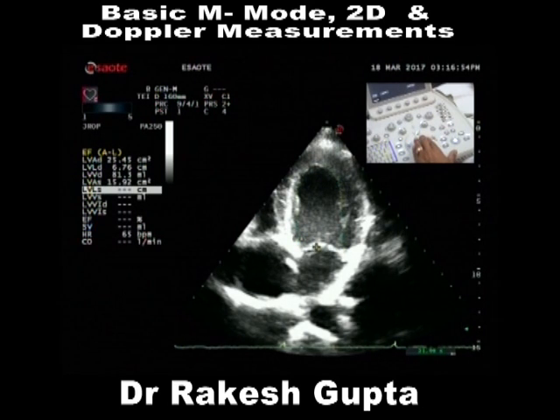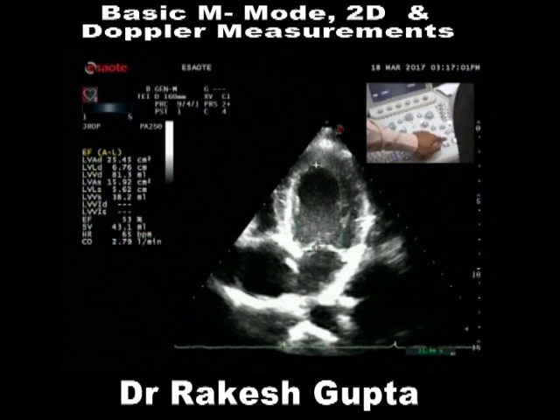That's area, center of this gives you volume, and now this is your ejection fraction, which is a global 4-chamber area. This is area, this is length. So this is the area-length method, 4-chamber ejection fraction is 53%.